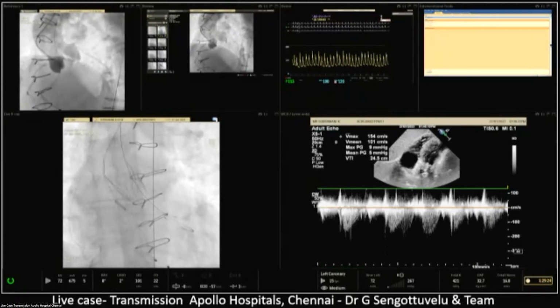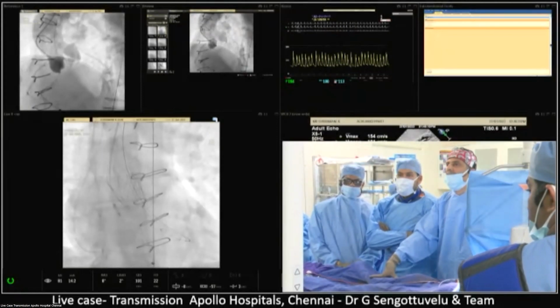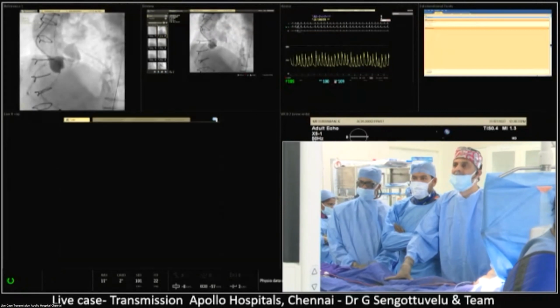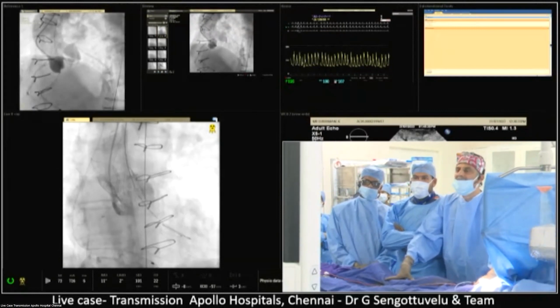Quickly, did you do an aortogram there? Yeah, I have done an aortogram. Show that, we can do one more. No, pigtail will be taken later because I want to make sure the wire is inside. I don't want the pigtail to be taken out with the wire. Ready? Picture. Yeah, it's holding on one side. The other side is a little high.